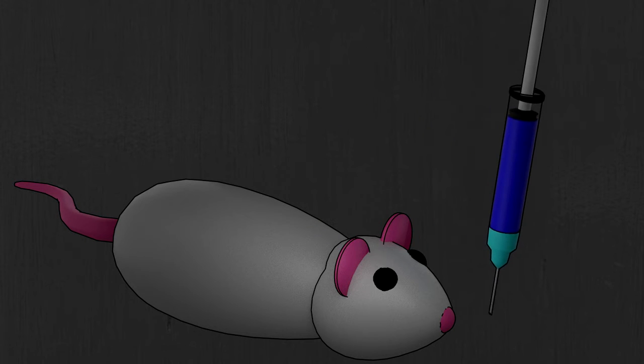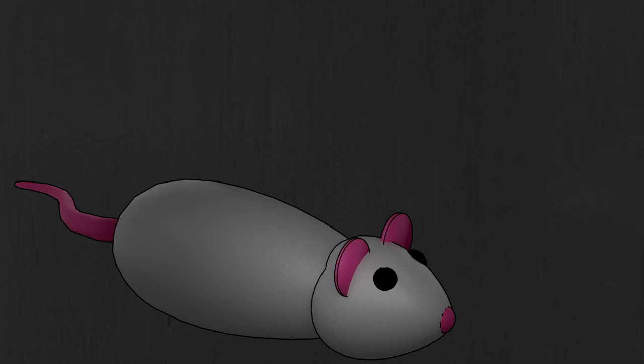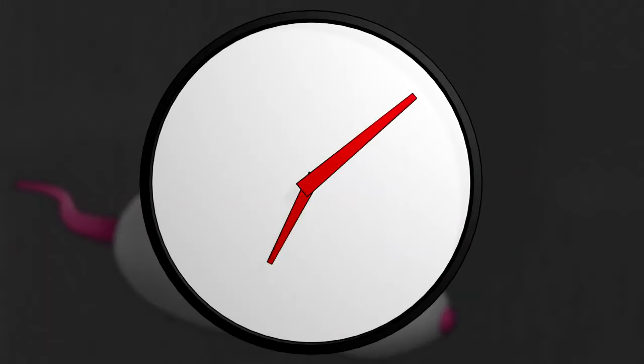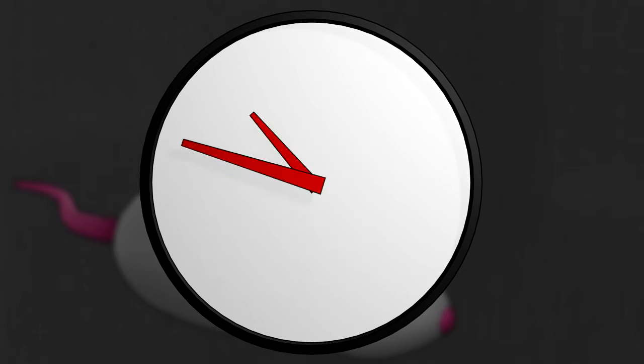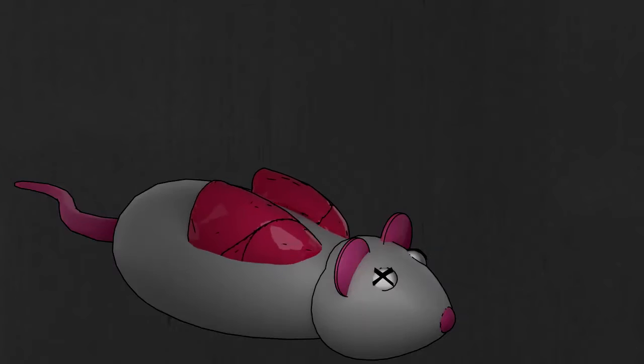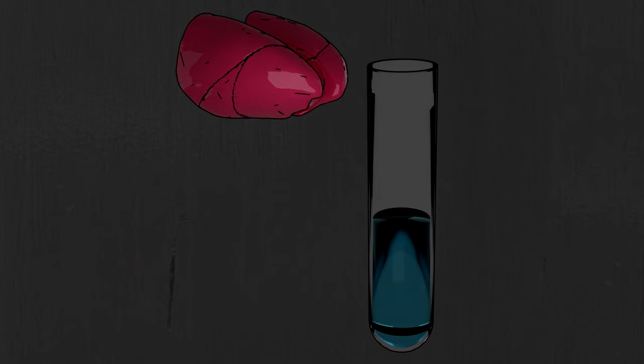We wait some time for the infection to progress and the immune system to respond before euthanizing the mouse for sampling. Normally, mice are sampled at intervals of 0, 3, 5, and 7 days. The organ of interest, in this case the lungs, are carefully removed and either flash frozen for later processing or placed into a solvent and homogenized immediately.